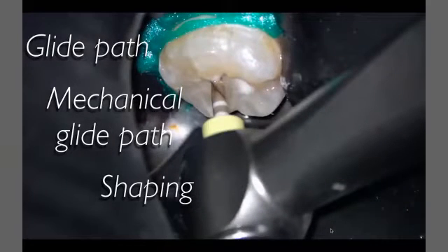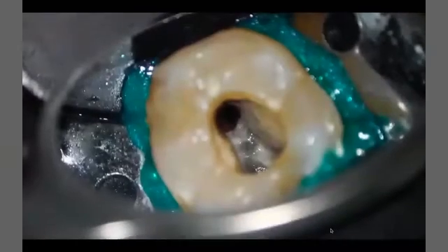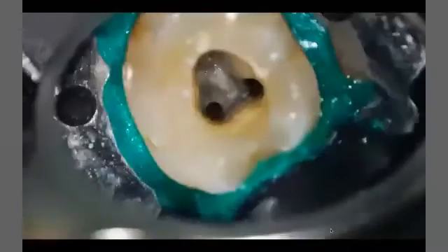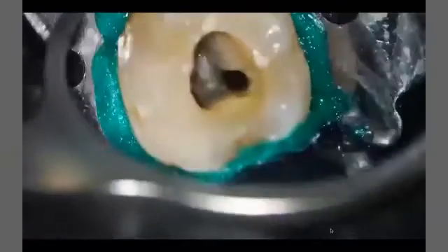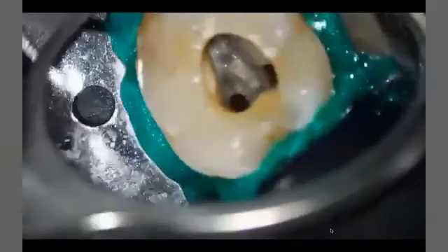So after shaping, as I told you, it's a normal root canal treatment. The obstacles are only on the coronal part. We have to clean the root canal, with activation. And now you can see here the floor map colors. Look at the difference. We have different colors.